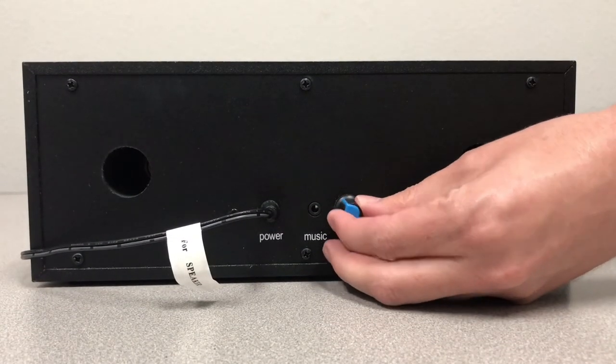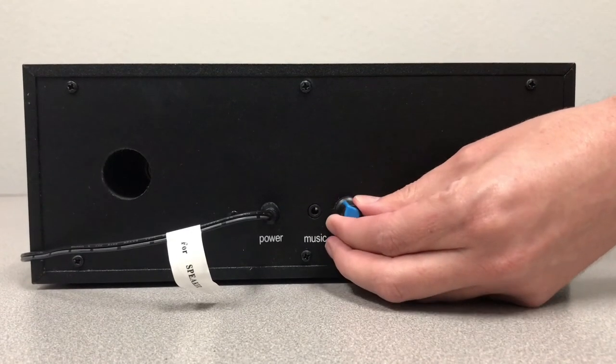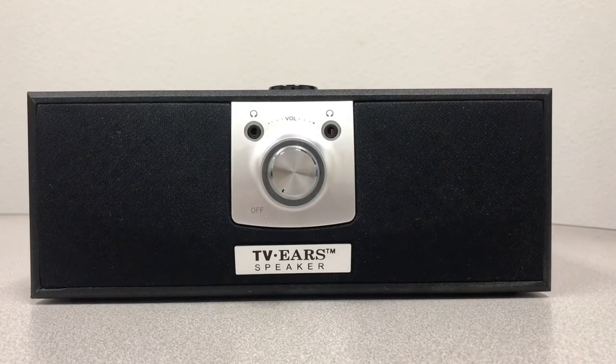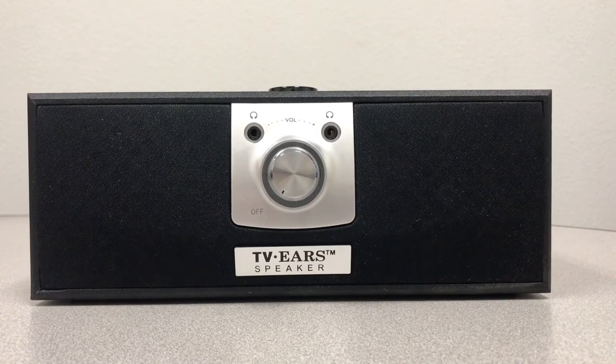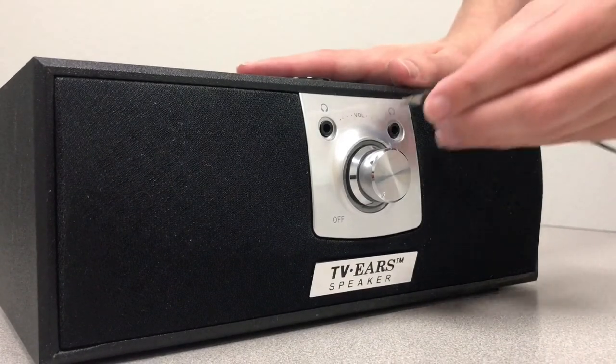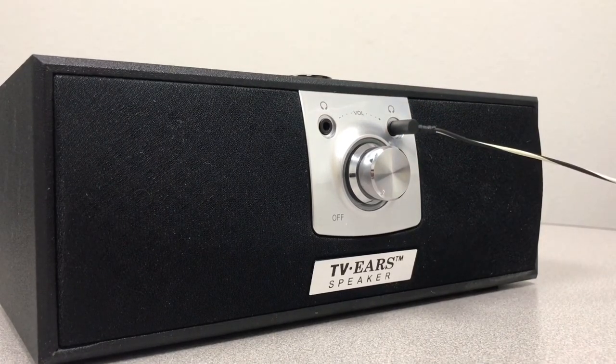On the back of the TVEARS speaker, there's a blue bass knob — adjust this to the bass level that you prefer. For private listening, the TVEARS speaker has two headphone jacks on the front, so up to two people can listen. Simply plug in your wired earbuds or headphones, and all the sound from the speaker will go into your earbuds or headphones instead.